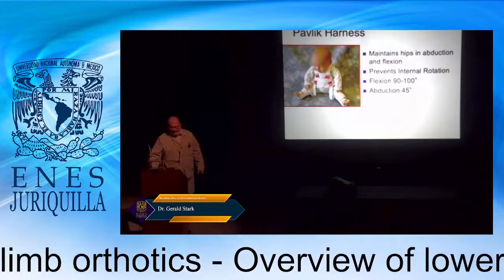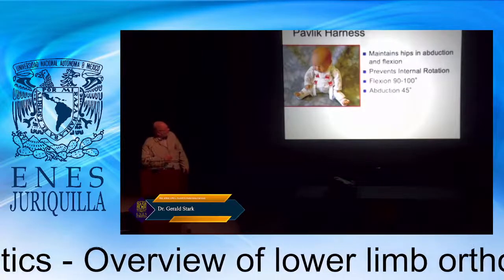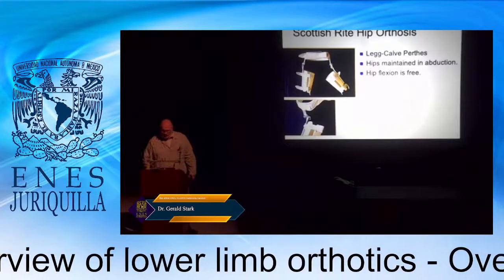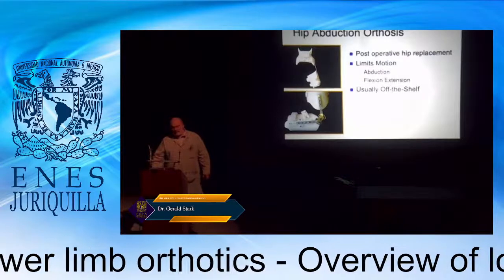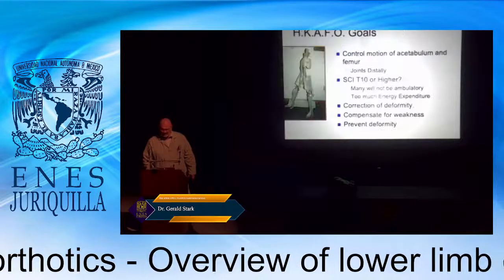So the Pavlik harness works in many of the same ways. This is an orthosis that keeps the leg in abduction, and the Scottish Rite does this for older children. And then finally, hip abduction orthoses for post-surgery when you have a hip replacement.